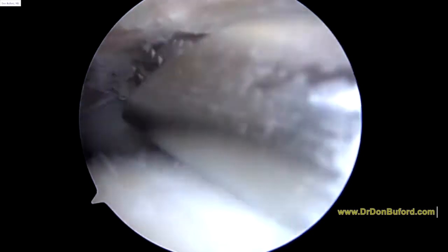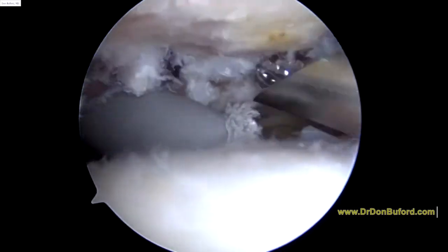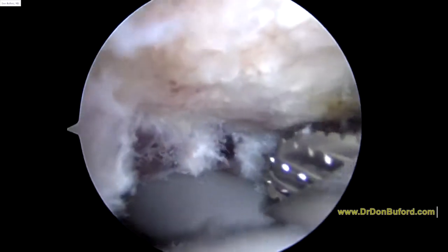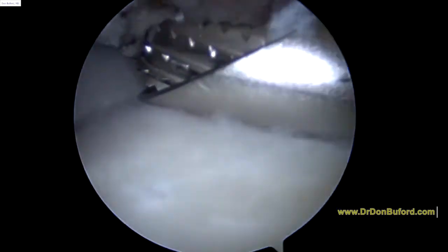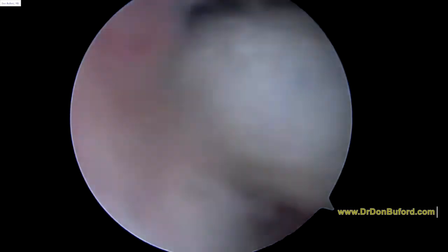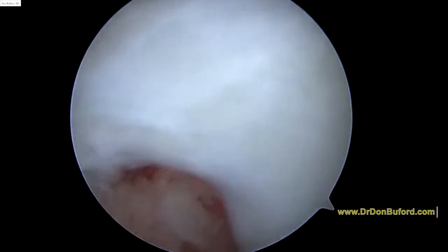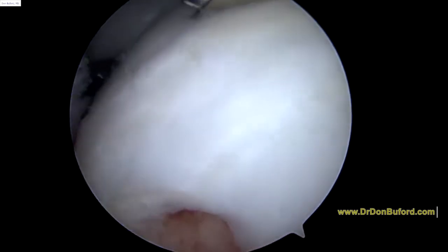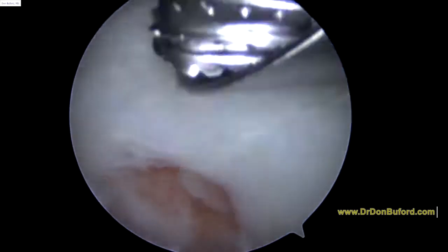We've kind of leveled out the acromion here at the top of the screen. It didn't require much, just the anterior lip of the acromion. And now we're going to get to work on deciding what to do with this rotator cuff. As we can see now, there it is. We're going to identify it a little bit better. We're going to clean up the edges because we know that the edges of this tendon are not healthy either.